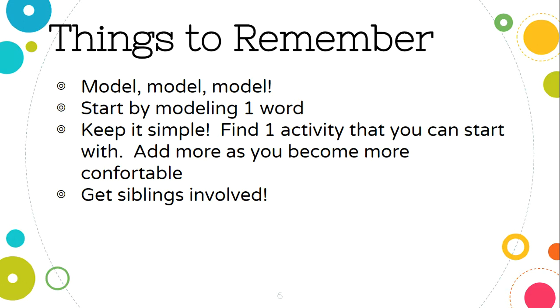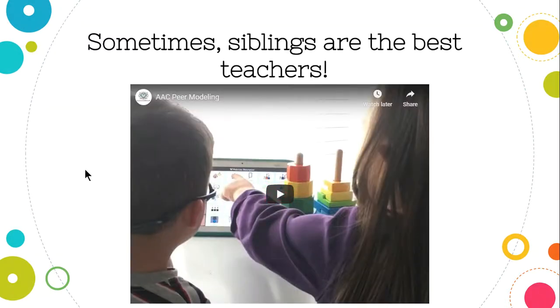Another suggestion I have, if you feel comfortable, is if your child has any siblings, to get your siblings involved. Sometimes peers are the best teachers for kids. And so them being able to interact with an older sibling or even a younger sibling while using the device can be really motivating. So we're going to watch this short video here. This is the same little boy from the previous video. And in this video, he's going to be playing with his sister and they're going to play with this stacking toy right here.